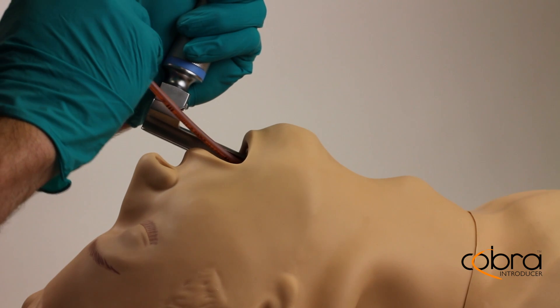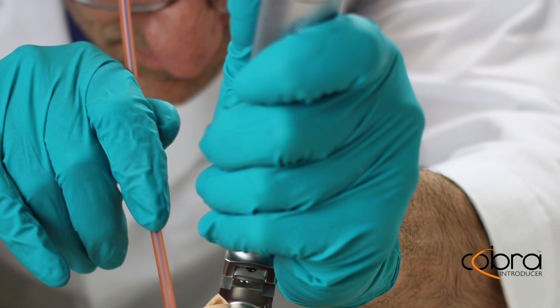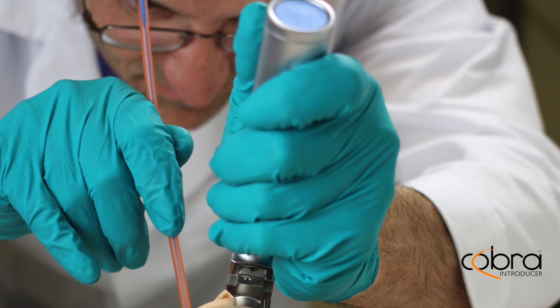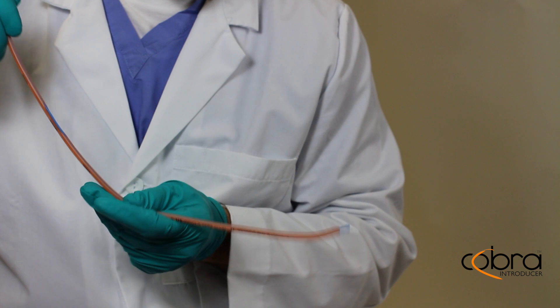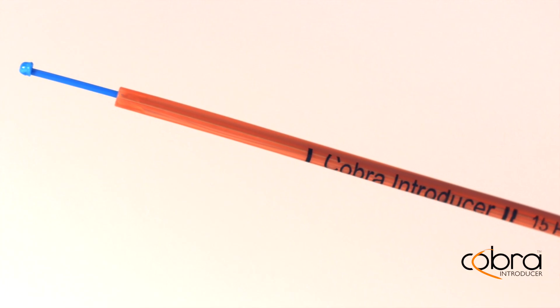The Cobra Introducer is an innovative intubation solution for difficult airways. With a simple design, this instrument empowers medical professionals to turn the 'I can see it, but I just can't get there' moment into a much easier and secured airway.